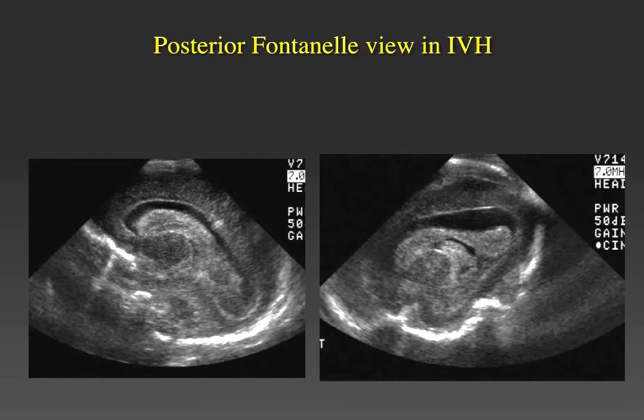The sagittal orientation is much more useful. Here is an example of a premature infant with intracranial intraventricular hemorrhage. The image on the left of the screen is obtained through the anterior fontanelle. With the patient in the same position, using the image on the right obtained through the posterior fontanelle, one can see the posterior aspect of the periventricular white matter as well as the atrium of the lateral ventricle much better using this approach.